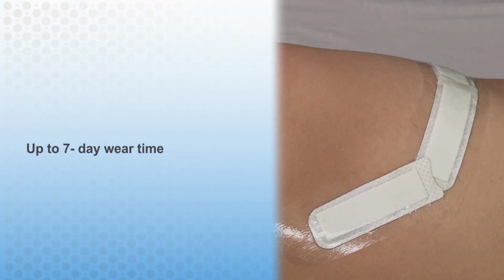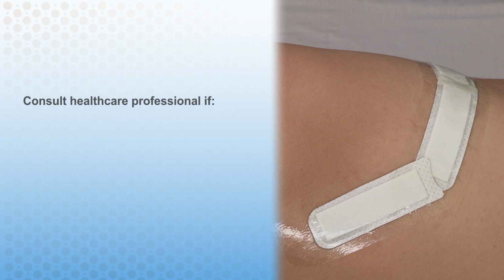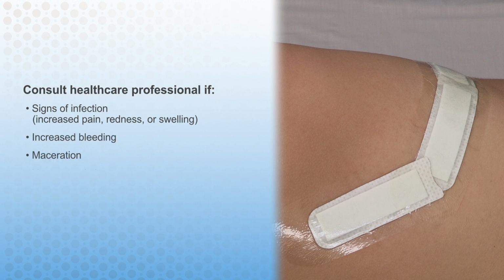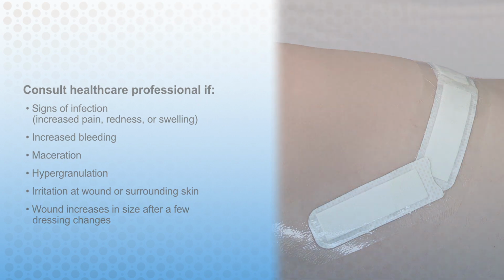Procellera FlexEFit may be left in place for up to 7 days unless otherwise prescribed. Earlier or more frequent changes may be required, depending on the amount of exudate present and the condition of the wound and surrounding skin. Consult a healthcare professional if any of the following occur. Signs of infection: increased pain, redness, or swelling, increased bleeding, maceration, hypergranulation, irritation at wound or surrounding skin. Wound increases in size after a few dressing changes.